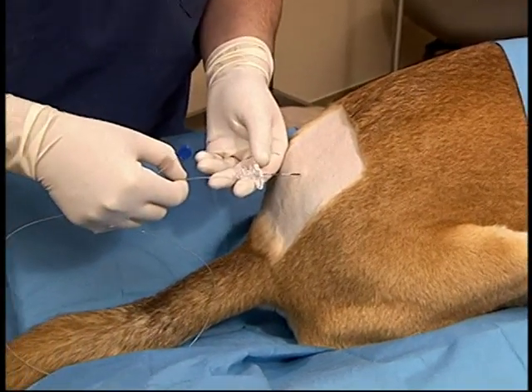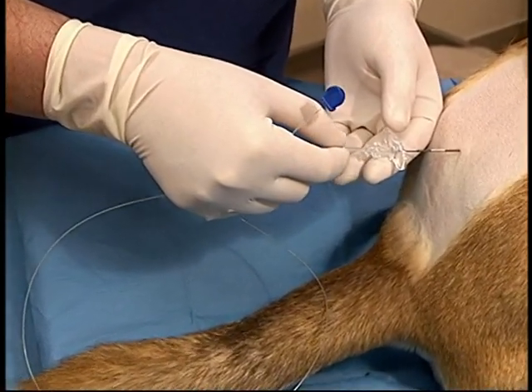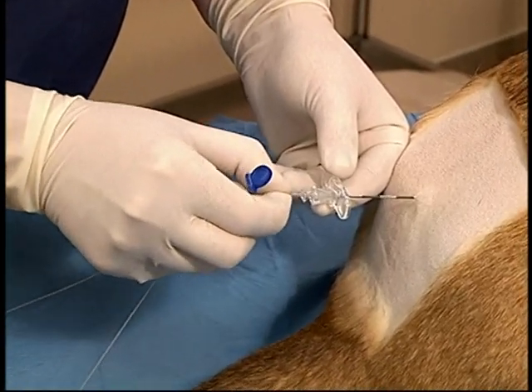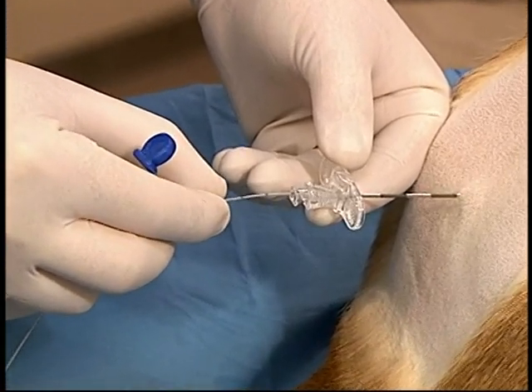The catheter is inserted into the needle. The thread assist device can be used if desired to facilitate placement. The needle may need to be angled slightly caudally to facilitate placement of the catheter. There will be minor resistance to passage of the catheter.